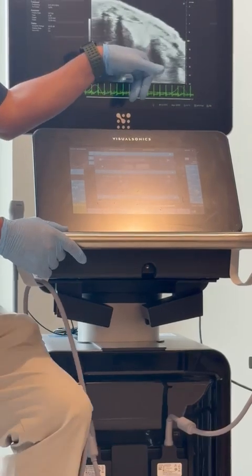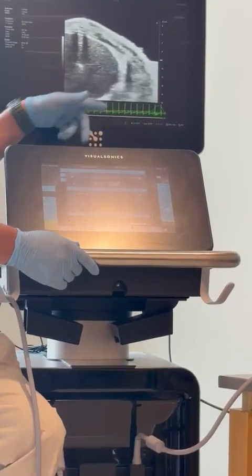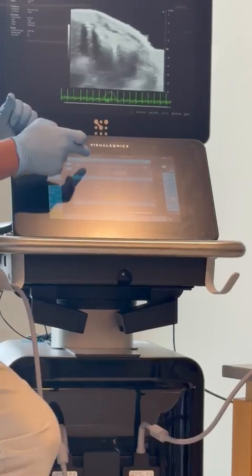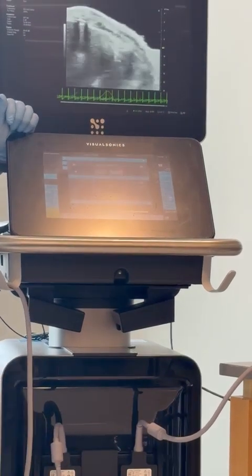past the middle of the heart all the way down towards, this is actually liver. We're just going to go a little bit further to make sure we capture all of it. This is all liver now. And I'm going to click and drag the start back to that position. You'll notice when I move my start or my stop, this bar moves. That's just setting my scan distance.